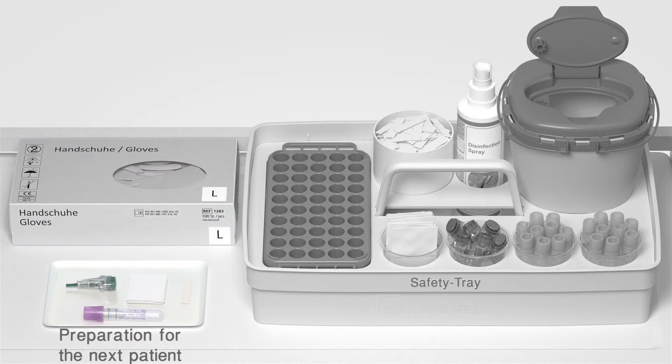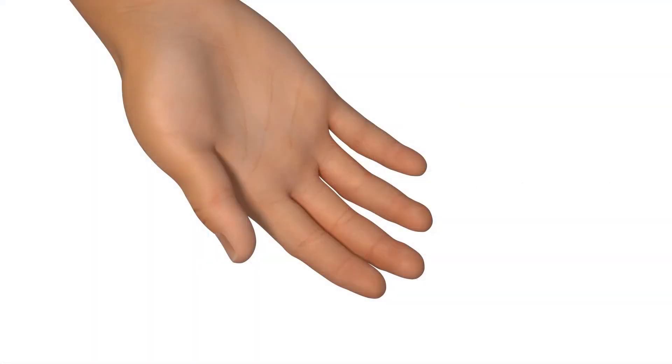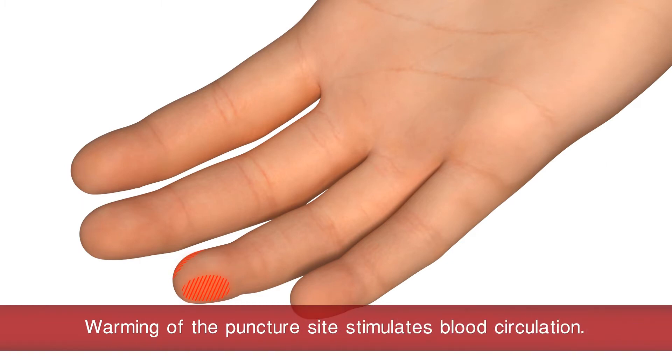Preparation for the next patient. Suitable puncture sites are located on the fingertip as shown in the marked area. Warming of the puncture site stimulates blood circulation.